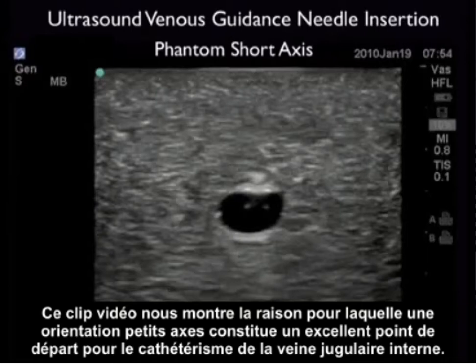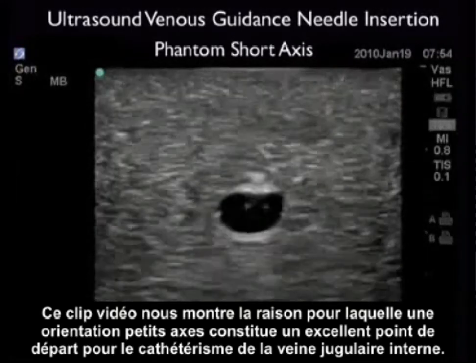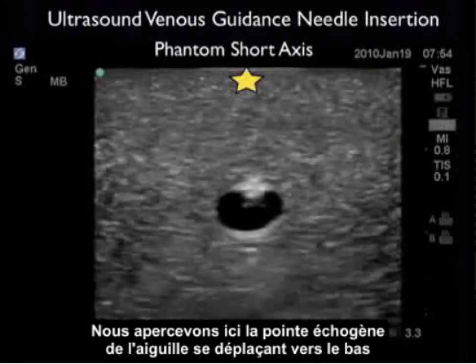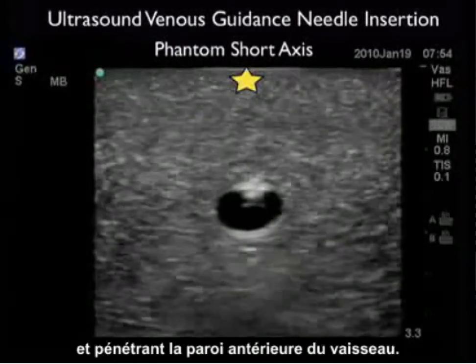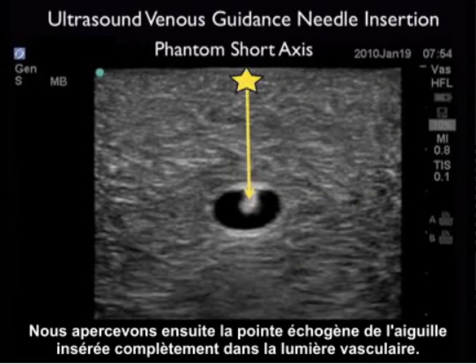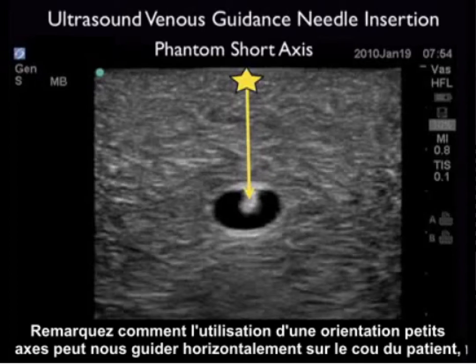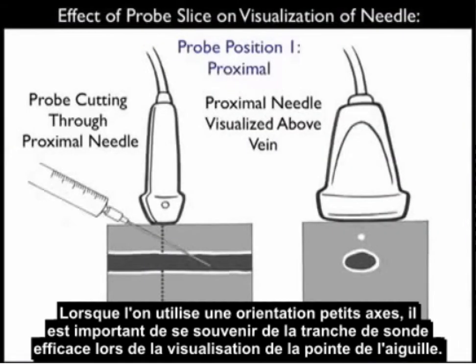This video clip shows why a short axis orientation is an excellent starting point for cannulation of an internal jugular vein. Here we see the echogenic tip of the needle coming down and permeating the anterior wall of the vessel, and we then note the echogenic tip of the needle squarely inside the lumen of the vessel. We can see how using the short axis orientation can guide us in a side-to-side orientation on the patient's neck in terms of lateral needle orientation with regard to the surface down to the vessel lumen.